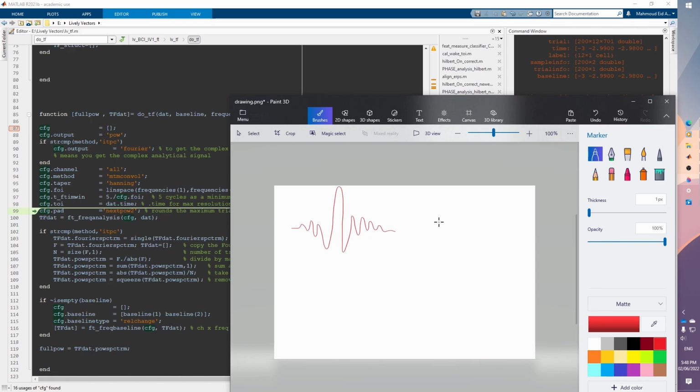Okay, and you can think of them as having a complex sine wave that is multiplied by a Gaussian mask. So it's almost like having a Gaussian kernel, and you are multiplying this to your complex wave that we have seen before.